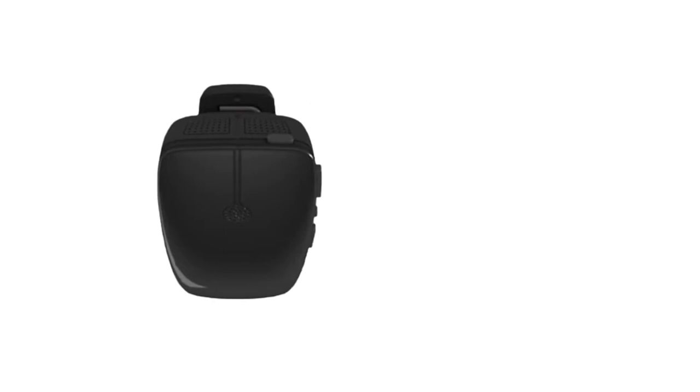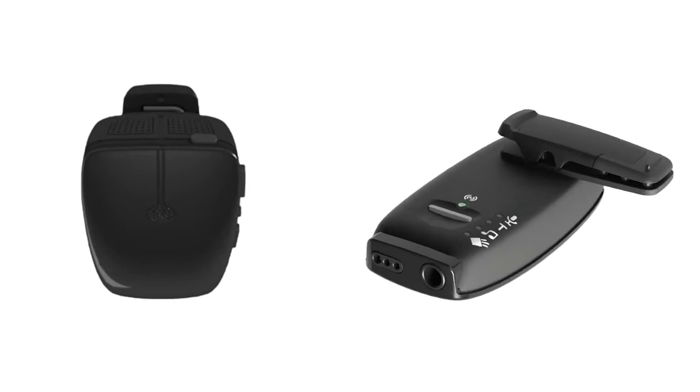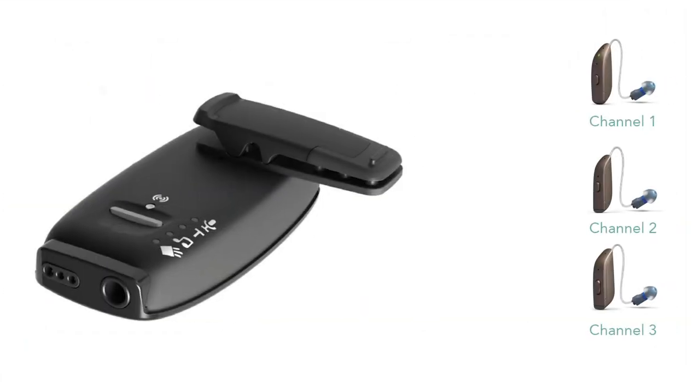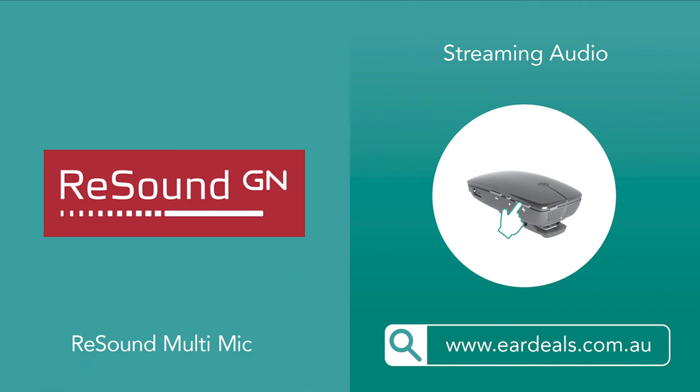To pair your hearing aids to the Multi Mic, on the back is a small button to wirelessly pair your devices. Using a pen tip or small pin, press the button. You will notice the LED light at the top will now flash orange, indicating it is ready to be paired in channel one. Ensure your devices are activated — once successful, you will hear a short musical melody in your devices, signifying they are successfully paired. If you are using multiple hearing aids or other streaming accessories, pressing the pairing button two or three times will switch between different audio channels.